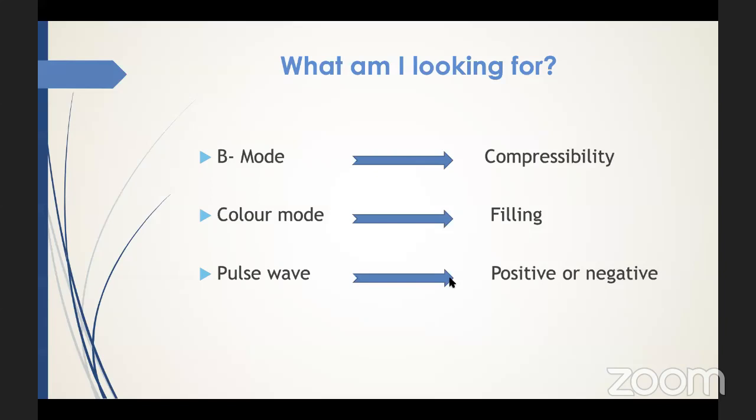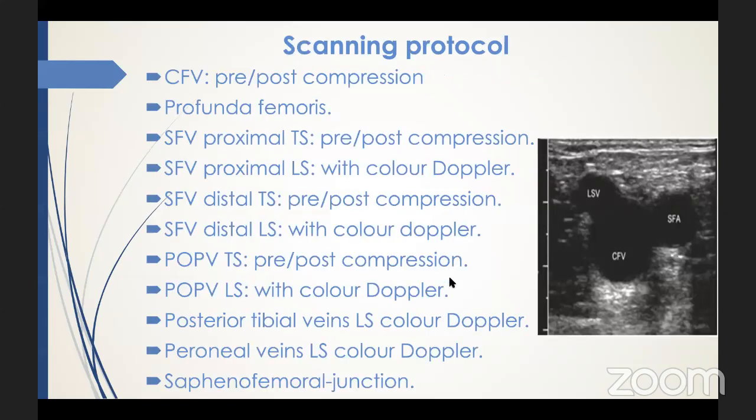Bear in mind the compressibility here is the gold standard, but in some circumstances we do not really tend to scan our patients, and even gentle compression is not permitted with a quite acute or floating thrombus, because this may cause other unwanted consequences. So this kind of protocol is quite busy. A slide here.